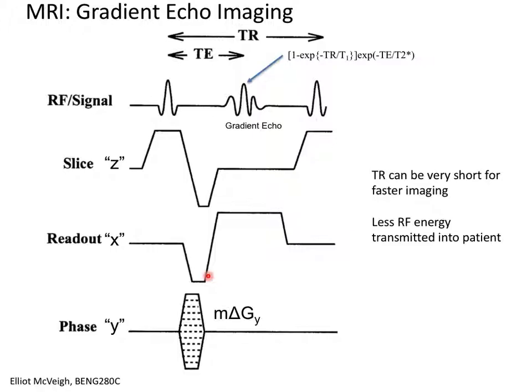And then when we apply the positive shift, there will be a point here where there is 0 phase shift in the X direction. There will be negative phase shift and then a positive phase shift. And so that takes us across actually the DC point in Fourier space where there is no phase shift. And that echo is what is generated by this rephasing of this gradient, and we sample that signal.